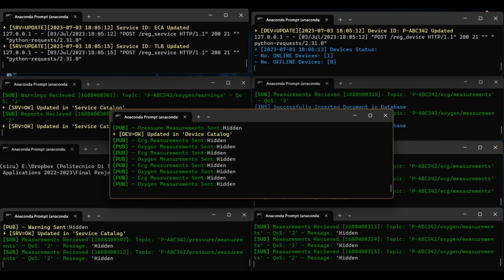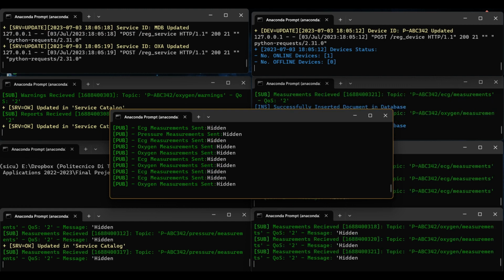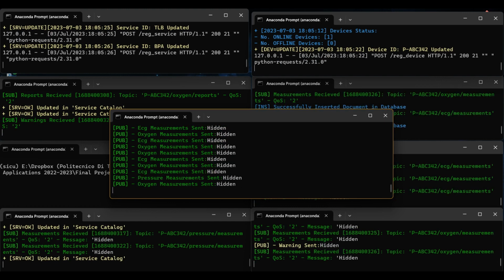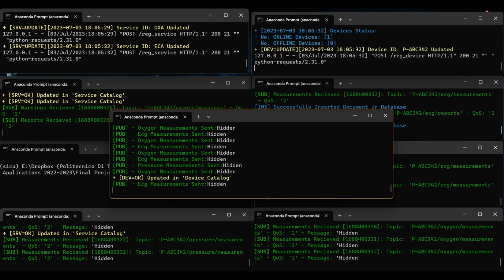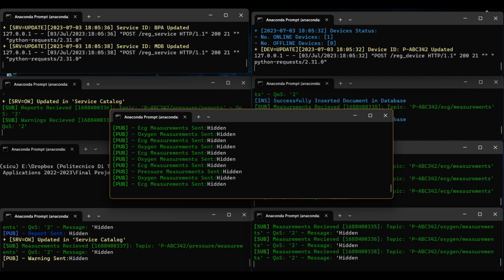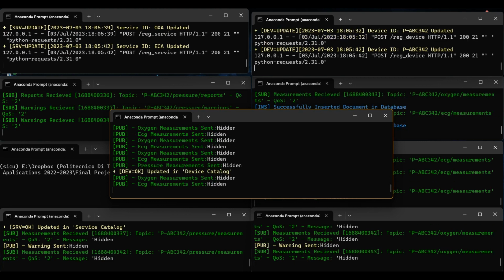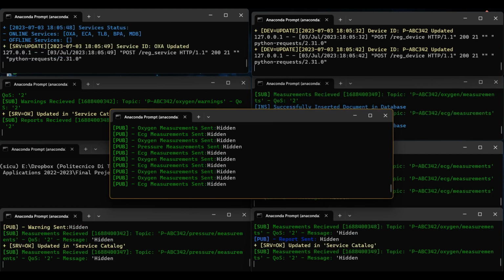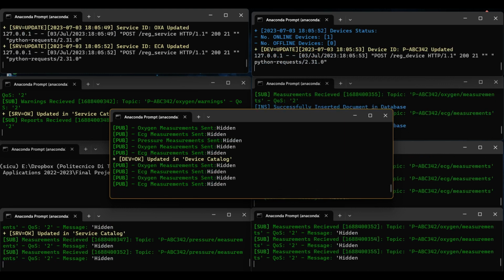Now that I'm running the gateway device file, as you can see, first it registers itself into the device catalog, and then different microservices are going to receive the information from the device, like the raw measurements. Some microservices like analysis tools are going to use these raw measurements in order to generate some warnings and reports. And also it's going to be stored into our MongoDB database, and the user interfaces, including the Streamlit and Telegram bot, are going to use these measurements in order to visualize them for the users.